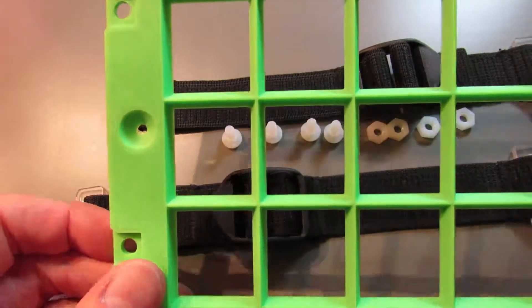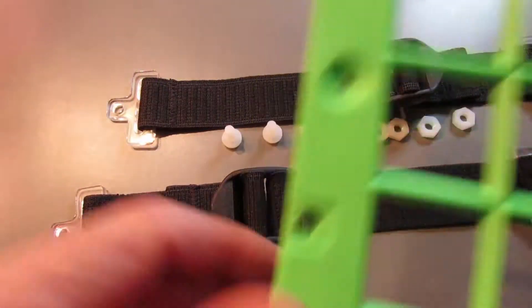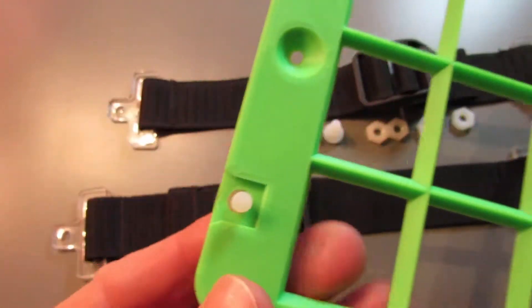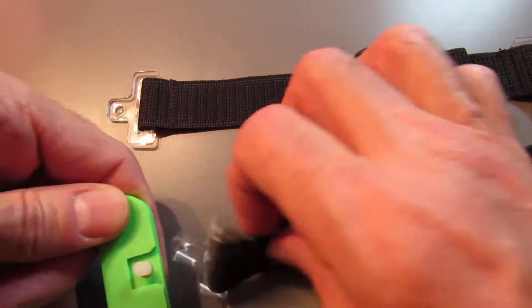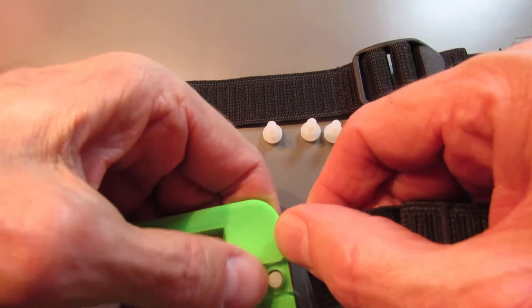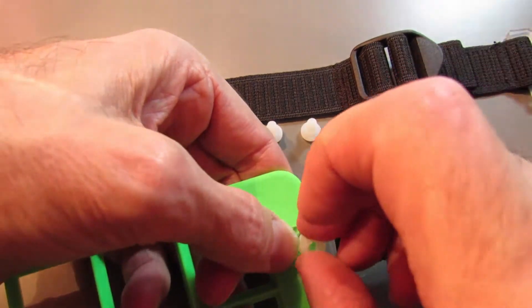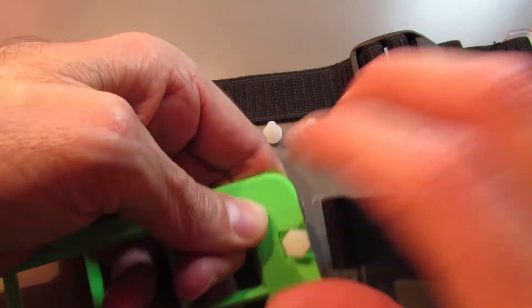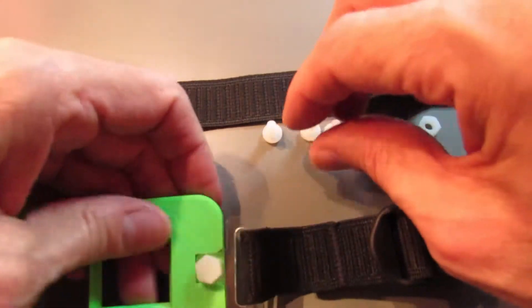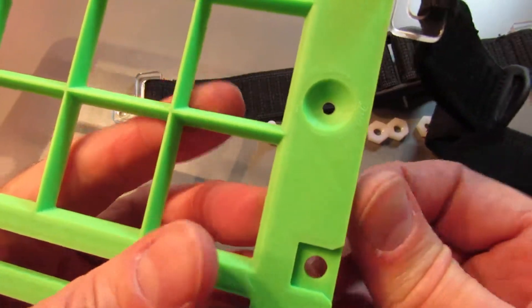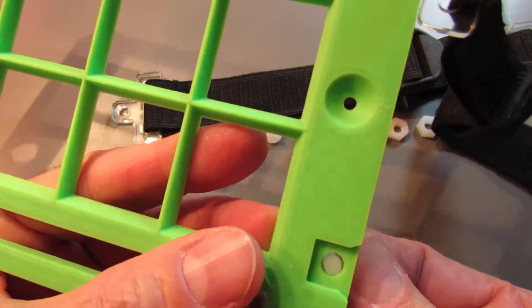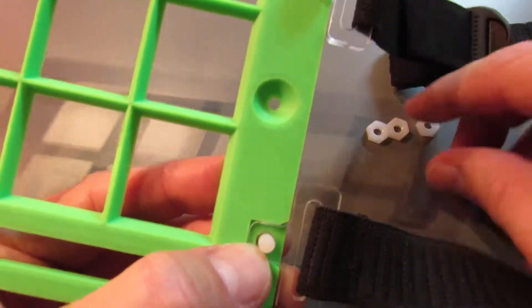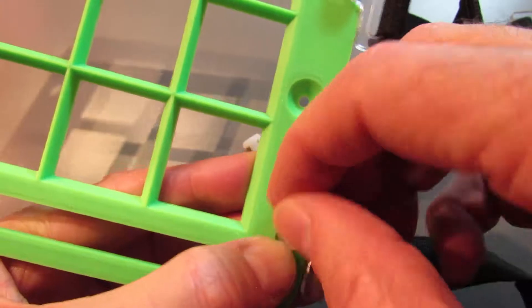So the way you assemble this is you take each screw and put it up through the bottom of the key guard, put the strap end in place, and then you put the nut on top. Finger tight's plenty. And repeat for all four of the holes.